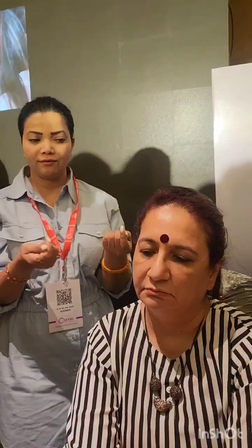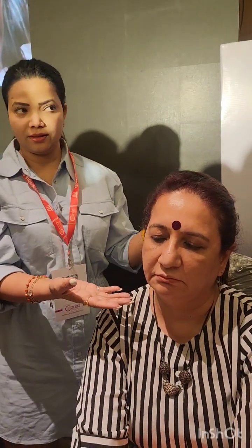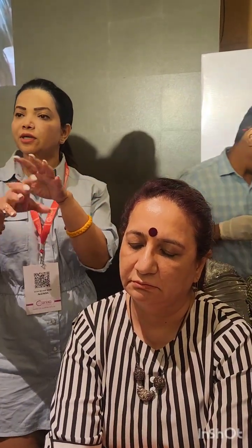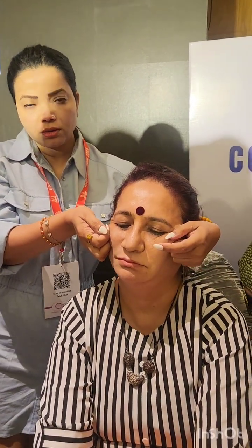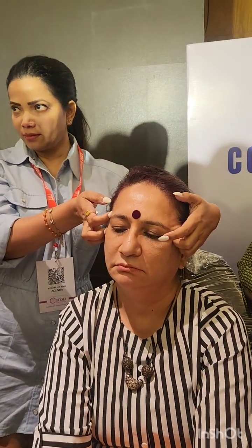If you are going superficial, it will give you the tightening. If there is a young patient, you just need to reposition for the youthful appearance. Just go a little superficial. But if you are handling a client like hers or me at my age, then you'll go a little deeper to pull back the entire fat over the original position.